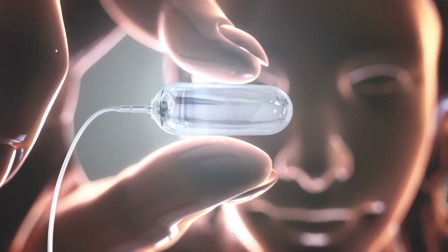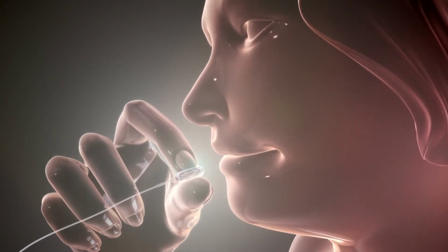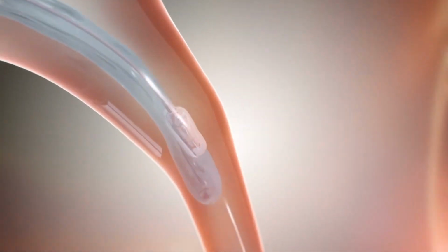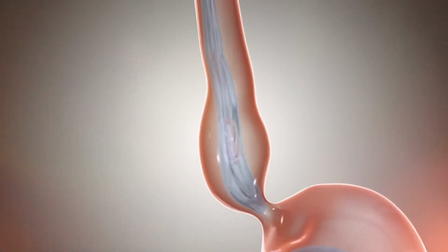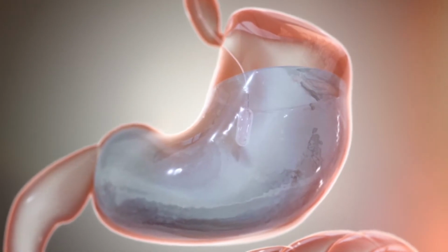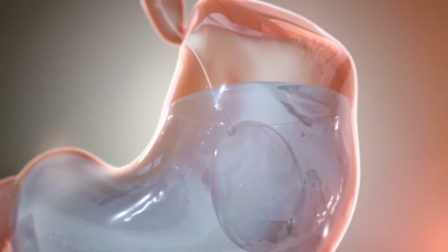And no anesthesia is required. Yes, it is true that to introduce a swallowable balloon, you don't require anesthesia. A swallowable intragastric balloon is a pill. You will swallow the balloon and its position is confirmed by using fluoroscopy. Once the position of the balloon is confirmed under fluoroscopy, the balloon is filled up to 400 to 550 ml.